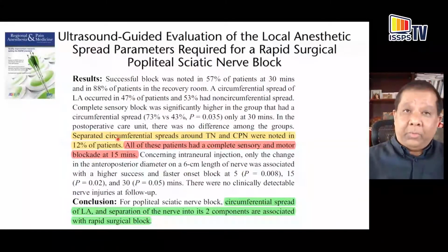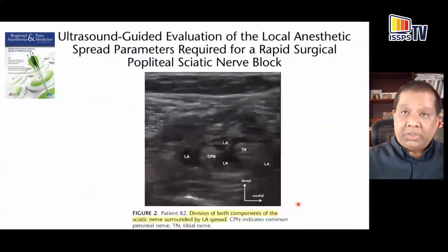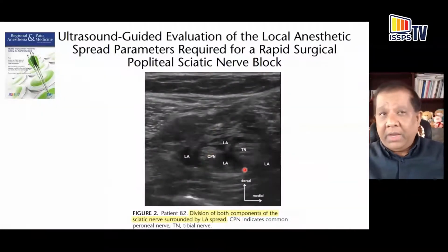Didier Moret and their group from Montpellier had already demonstrated that if you had separation of the tibial and common peroneal nerve during an ultrasound-guided sciatic nerve block, they reported that sensory motor block was complete within 15 minutes, and the separation of the sciatic nerve into two components was often associated with a very rapid surgical block. Now, this is a picture they presented many, many years ago.